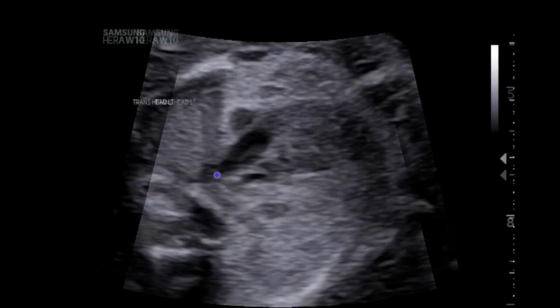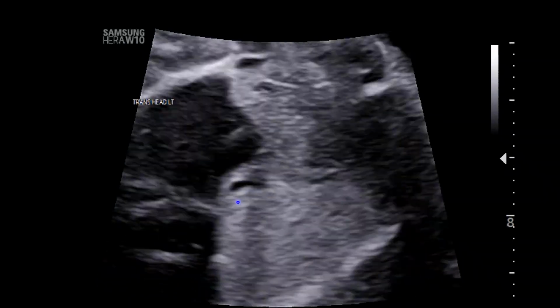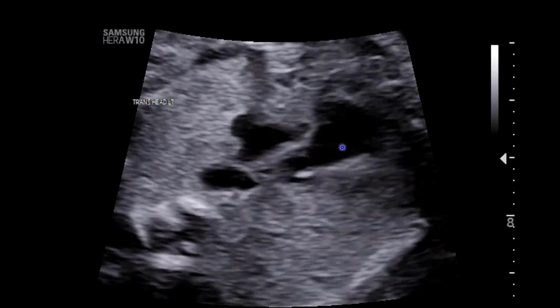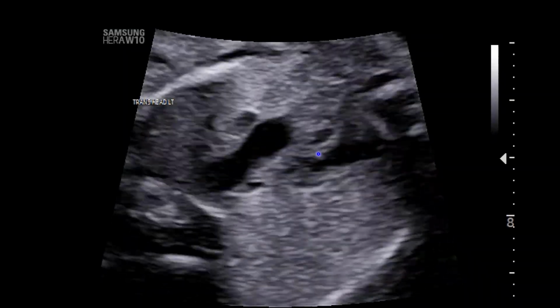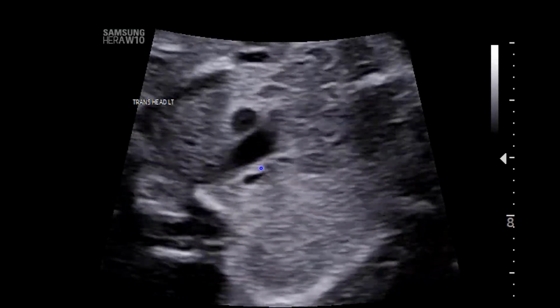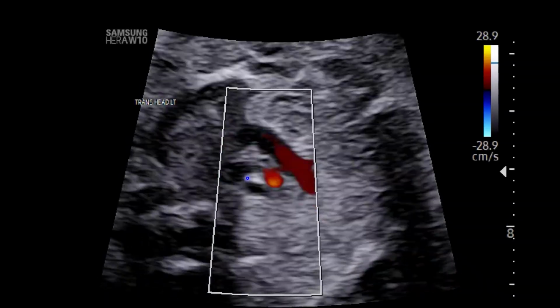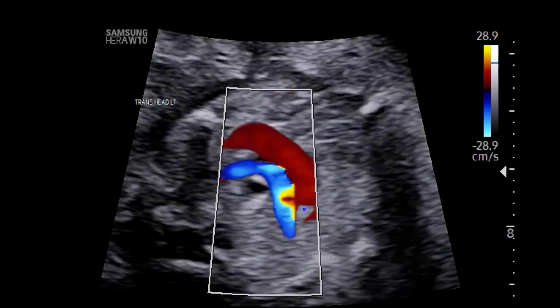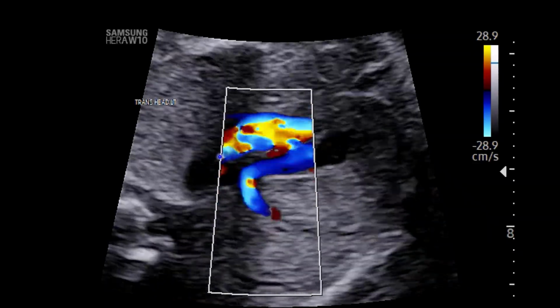So right aortic arch, and we're going to look to see, is there something going behind the trachea? Is there a ductal structure going behind the trachea? This is RVOT, little small pulmonary valve there. This is a tetralogy of Fallot case, and we're seeing the trachea really clearly here. And as we apply color Doppler, this is the innominate vein here, flowing up on the screen toward that right SVC. There's the right aortic arch there.